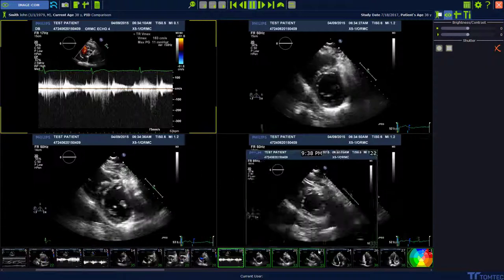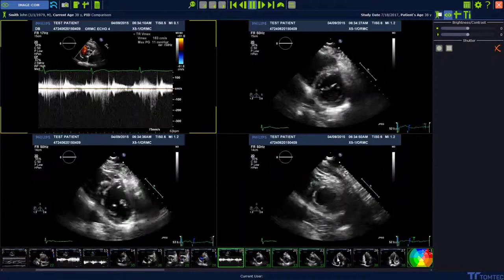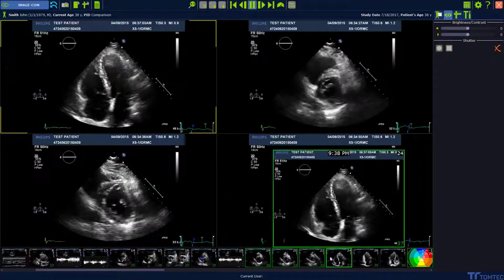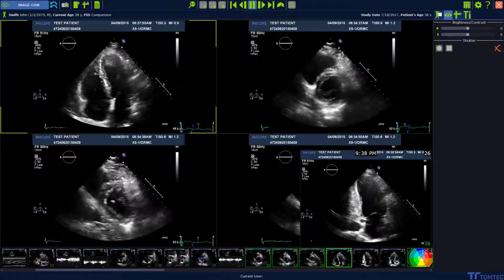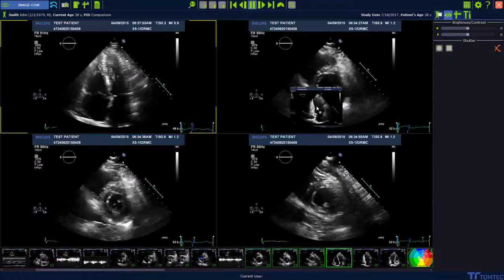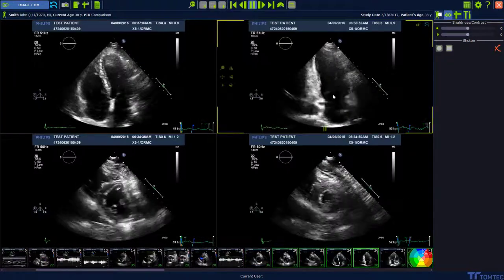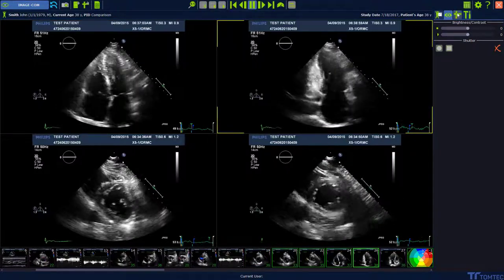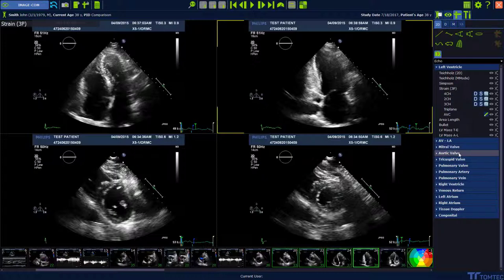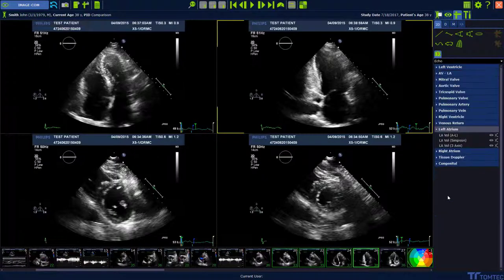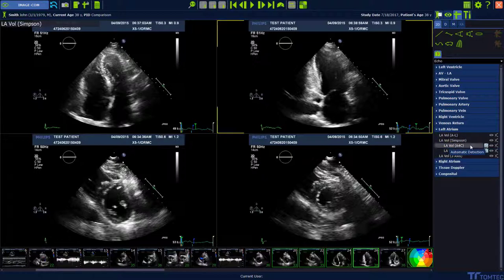To start the analysis, we drag and drop an apical 4-chamber view and a 2-chamber view in the workspace. Then select the measurement package, and here the left atrium, and under the left atrium we find left atrium volume Simpson analysis.